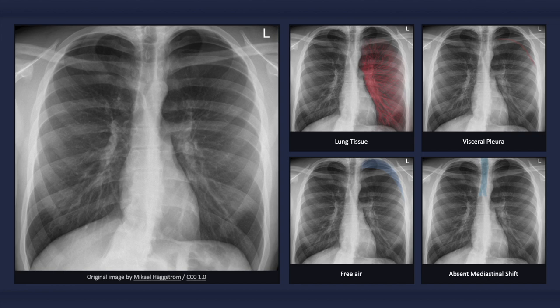Although most X-rays are taken in the erect position — since this way air collects superiorly and laterally — unfortunately not all patients can stand. When the radiograph is taken with the patient in the supine position, air actually collects basally. In that position, the anterior and lateral costophrenic sulci are the highest points in which free pleural air can collect. When air collects in this location, it may result in a deep sulcus sign, which is an indirect sign of a pneumothorax.